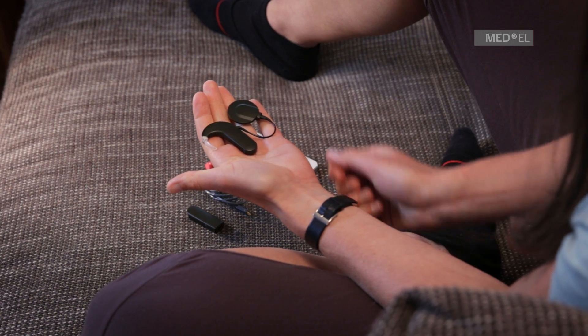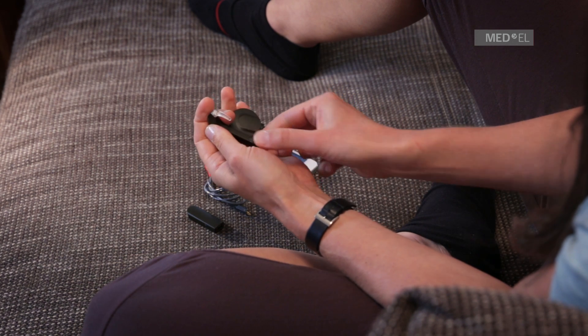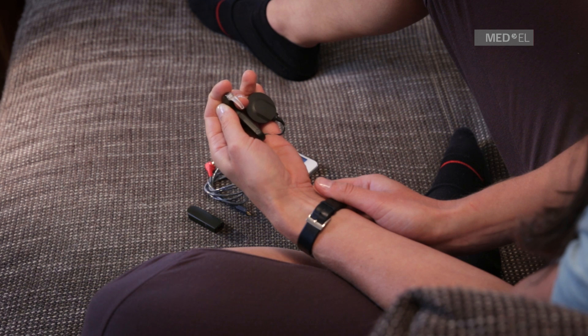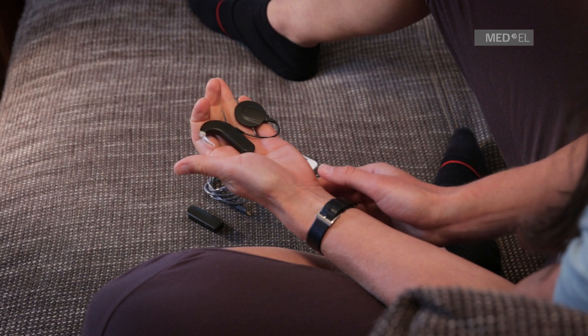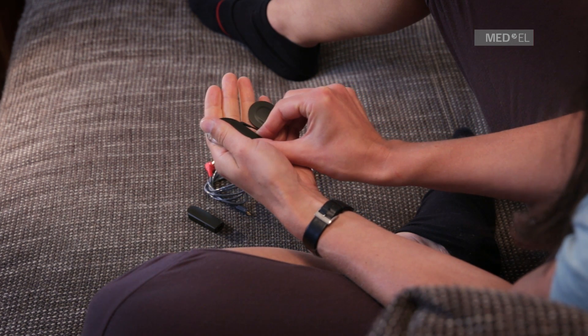Remove the standard battery pack cover. Make sure that the battery pack cover lock is in the unlocked position. If it is not in the unlocked position, use the screwdriver provided with your Sonnet kit to turn it counterclockwise into the unlocked position. Be careful not to use too much force.